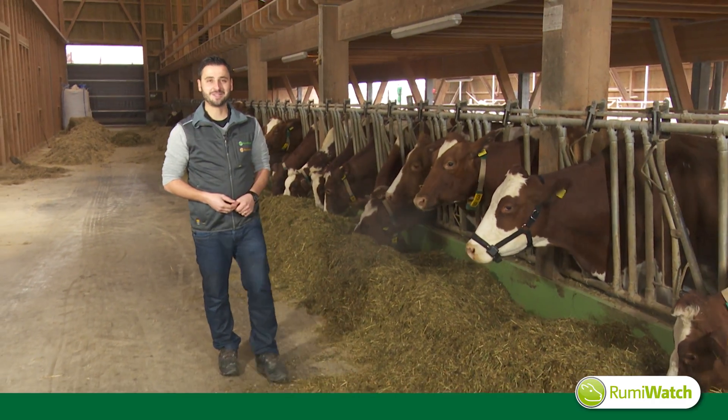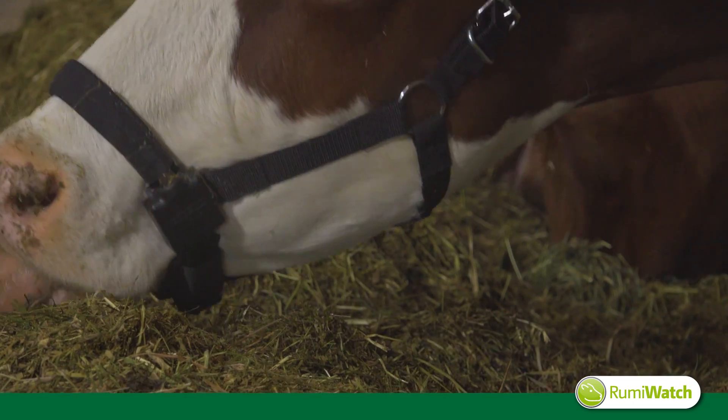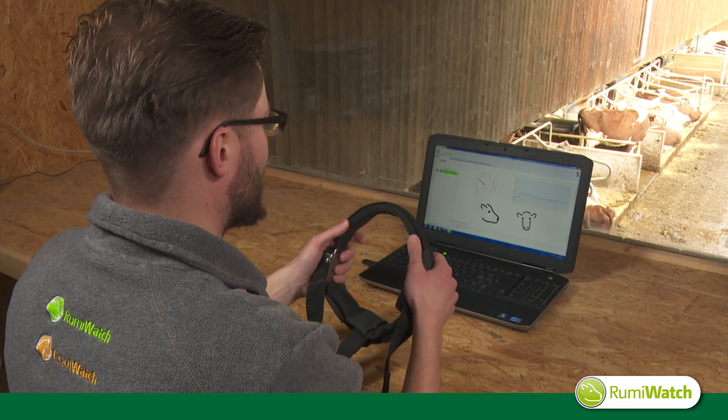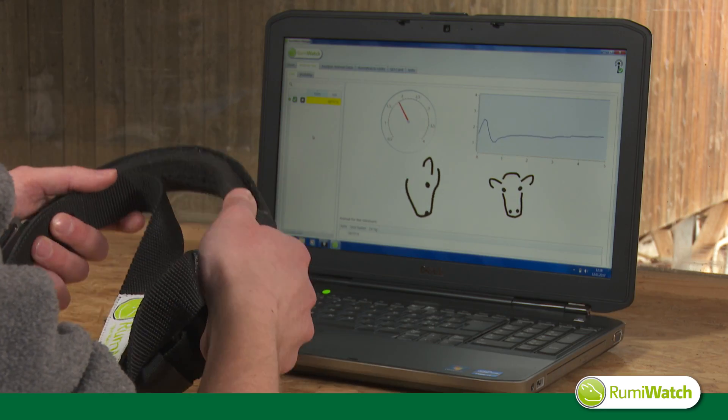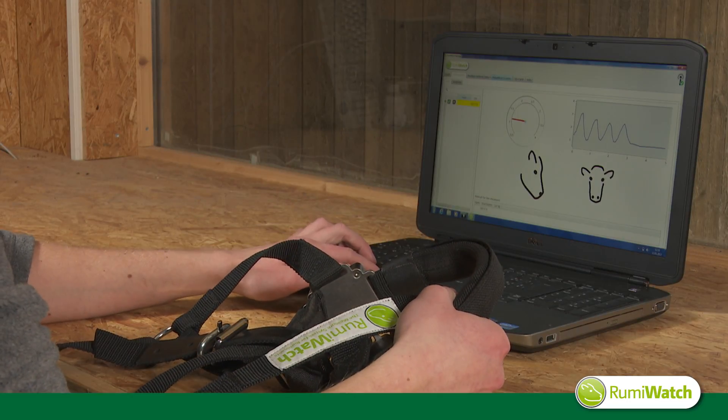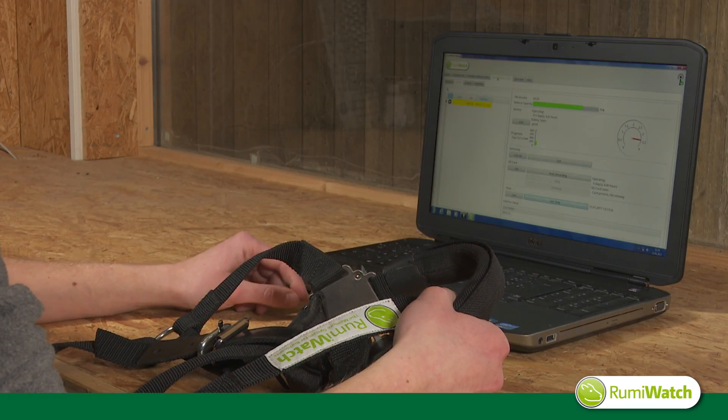So let's start the measurement. First we need to set up the system. Therefore we use the RumiWatch manager software. The pre-settings like preparing the SD card are essential for raw data recording and can easily be done inside the program.